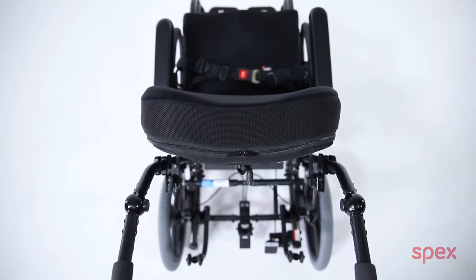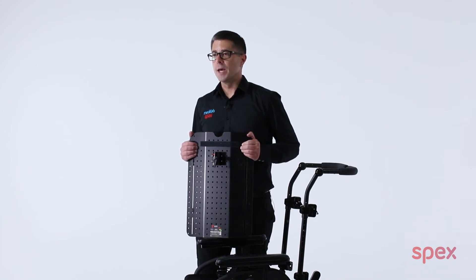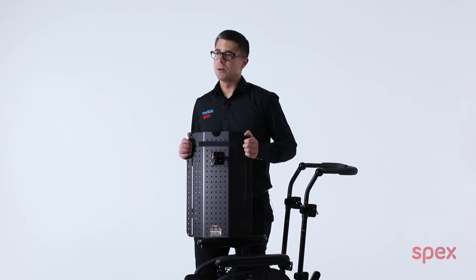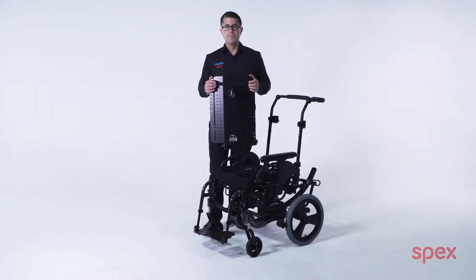Some wheelchair users require a wider back support than what will usually fit onto the wheelchair. For example, if a person has a 16 inch wide wheelchair, they may require an 18 inch back support installed. Some reasons for this can be because the person has a broader trunk and a wider back support is necessary. Another consideration is for people that have complex spinal asymmetries, where a wider back is necessary to achieve more support and lateral contouring around the person's trunk.